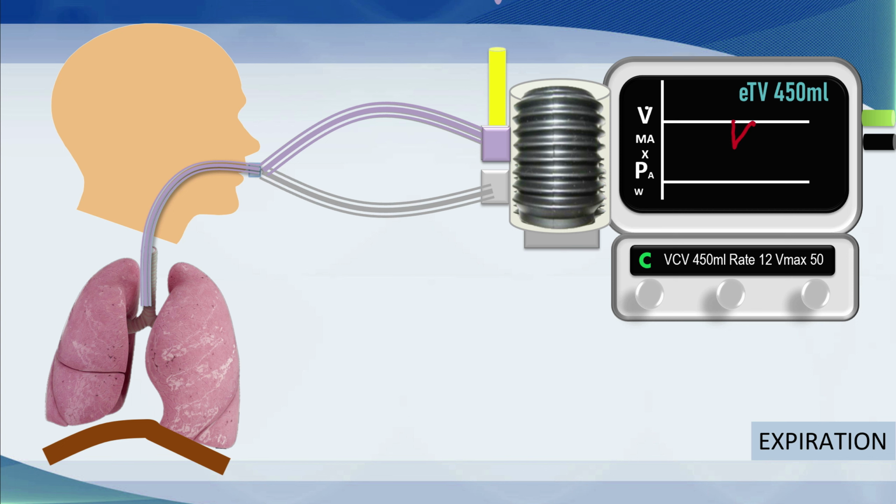Above that, you will note another number, that is the exhaled tidal volume. And this is the most important number that's delivered. This is the volume that comes out of the patient's lungs. It's what the patient exhales. So we have two different numbers for tidal volume: the inspired tidal volume, which is what the ventilator delivers, and the expired tidal volume, what the expiratory sensors recognize coming out of the patient.